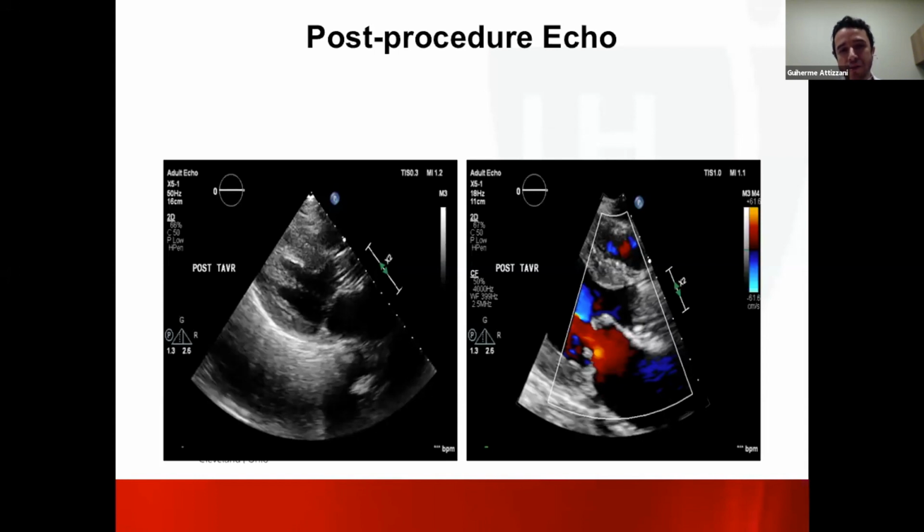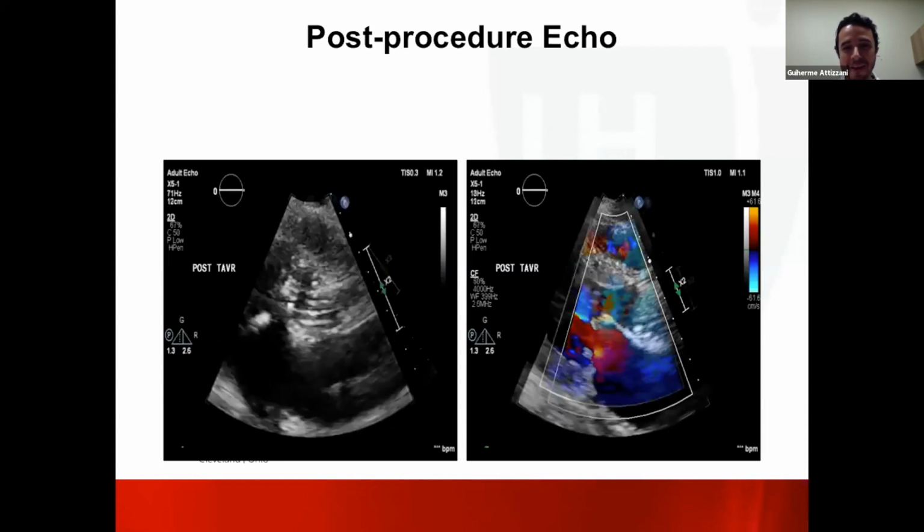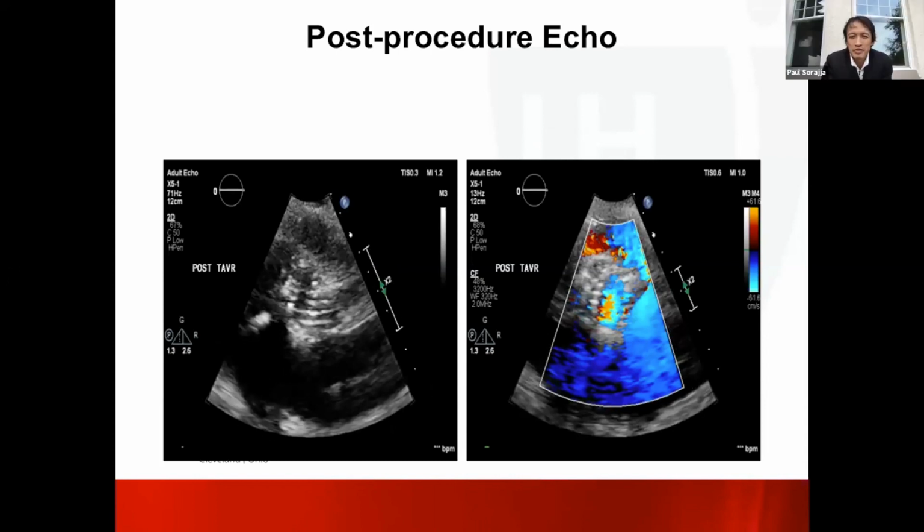Well, so I would like to show you the echo. I apologize again for this not playing. This is the first time this happens with this presentation, but anyway, I promise you that there's no paravalvular leak, okay? You guys are gonna have to trust me here on this one. No PVL. Well, that image was frozen in diastole, so we trust you.